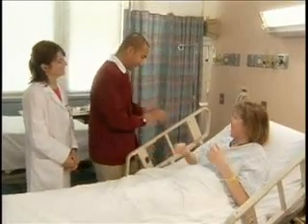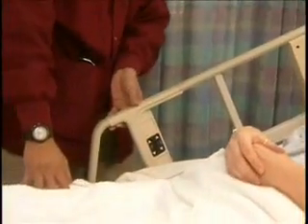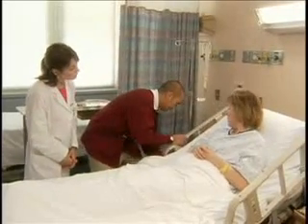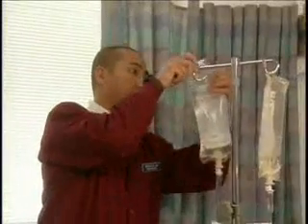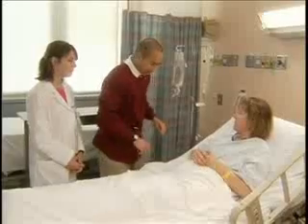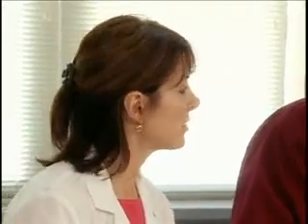I'm just going to get started, okay? Okay. First, I'm going to raise your bed up. There we go. And I'm going to lower your railings. Now I'm just going to hang the IV bag and tubing on the IV pole. And then I'm going to clamp off the existing IV tubing. Also close the clamp on the short extension tubing connected to the catheter in the patient's arm.